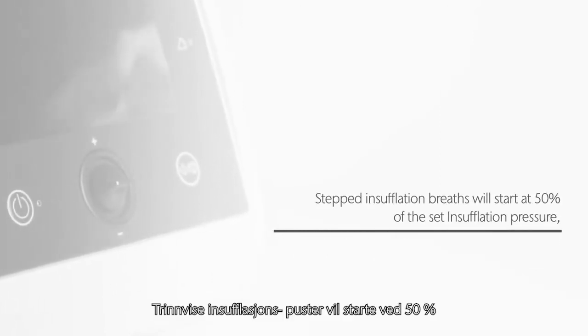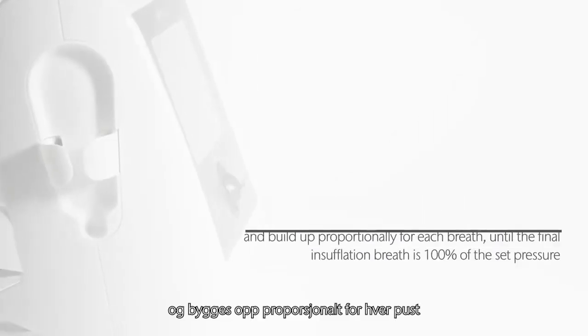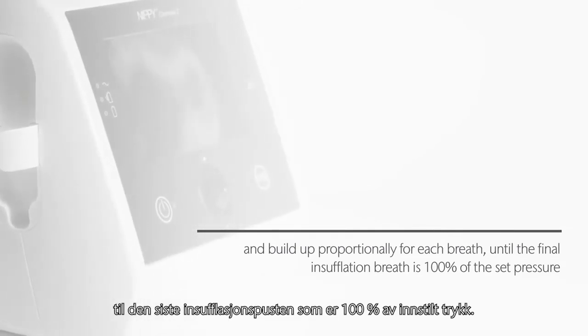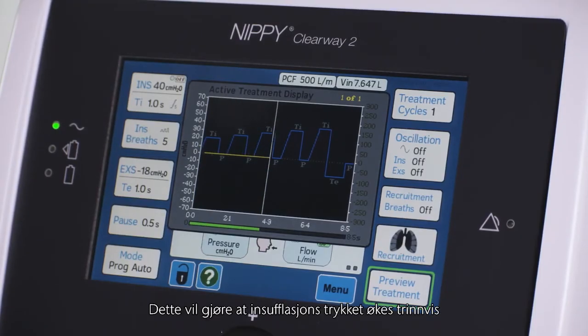Stepped insufflation breaths will start at 50% of the set insufflation pressure and build up proportionally for each breath until the final insufflation breath is 100% of the set pressure. This will create a stepped insufflation waveform.